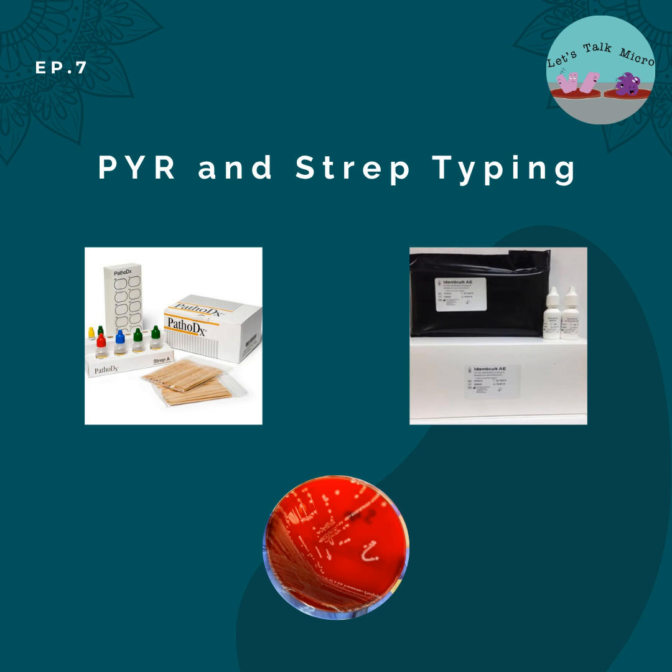You have a disc PYR test, which you moisten a disc with water and then apply the colony. You wait 2 minutes and add your developer. And a pink color is considered a positive result.